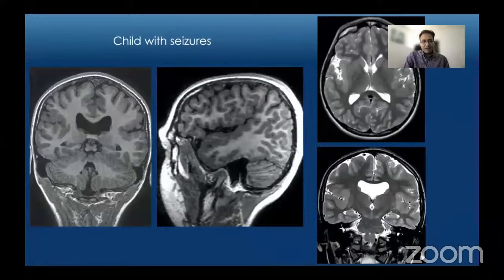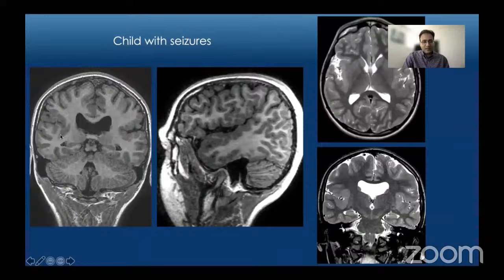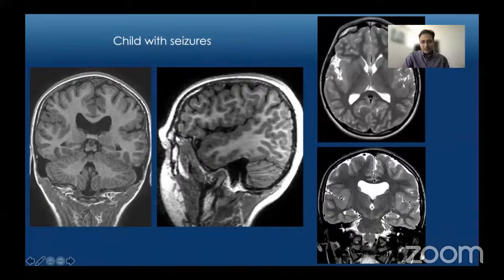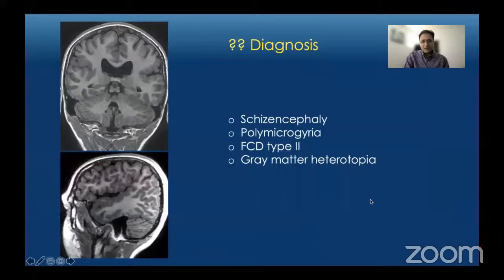Moving to case number three: a child who presented with seizures. On coronal and sagittal T1 MPRAGE sequences we see abnormally thickened and lobular-appearing cortex in the right and left perisylvian regions. On the sagittal images there is an abnormally deep sylvian fissure extending all the way up to the vertex, lined by thickened lobular cortex. On T2-weighted images we see abnormally thickened and lobular cortex in bilateral perisylvian regions, and absence of septum pellucidum. The diagnosis is bilateral perisylvian polymicrogyria.